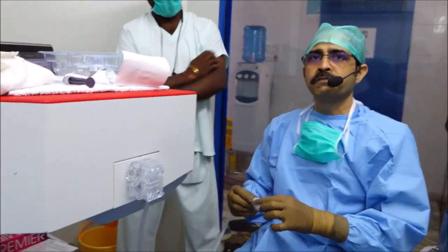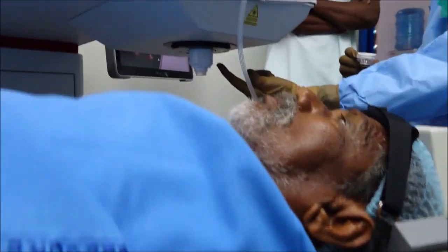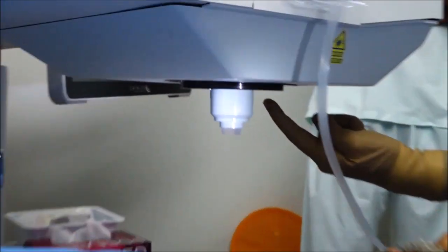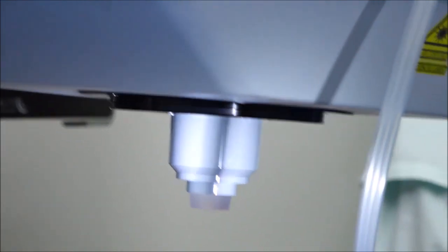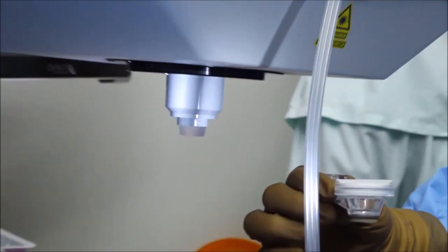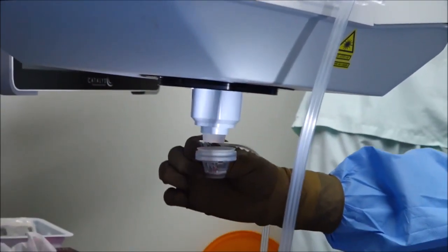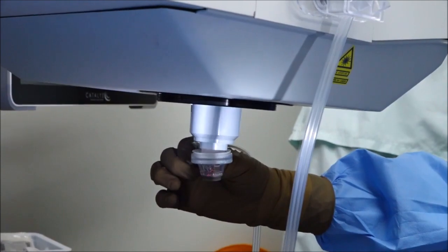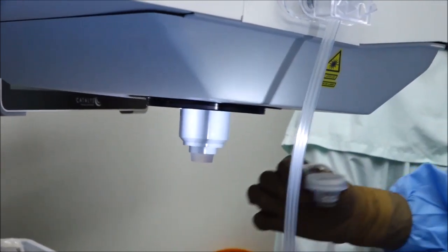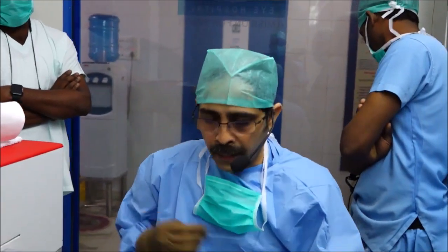The disposable lens is fitted onto the machine. The LOI is placed on the patient's eye and coupled together with the disposable lens. This gives excellent OCT and laser delivery.